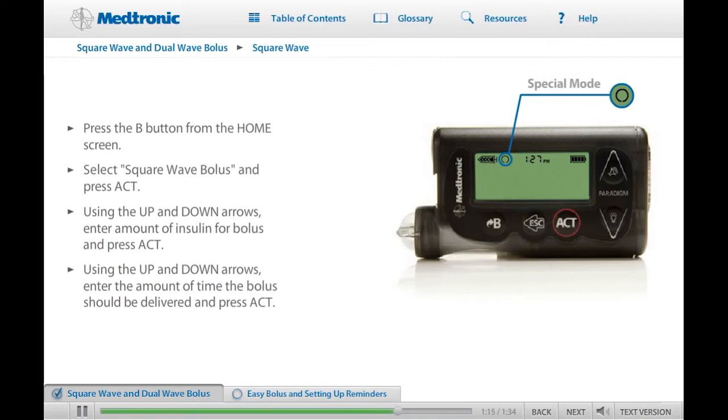Please note: if you have the Bolus Wizard feature turned on and you have a high glucose, Square Wave Bolus will not be shown as an option. You can practice programming a Square Wave Bolus now if you like. Please ensure that you are not connected to your pump while you practice. When you are ready, click Next to continue.